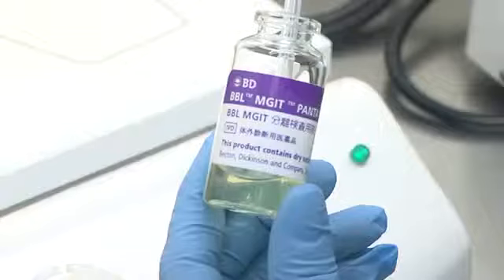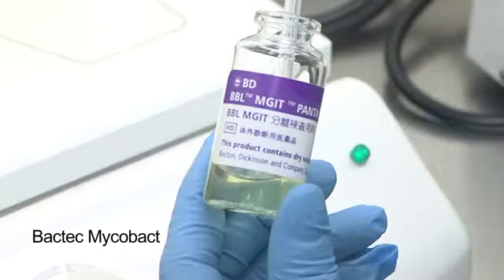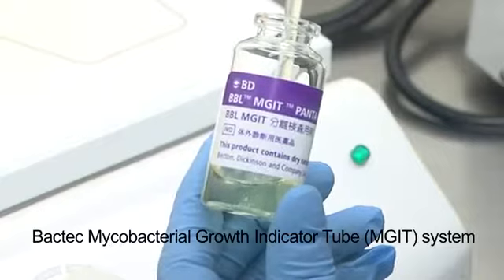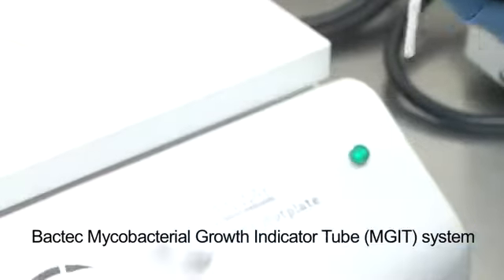The final buffered deposit is inoculated into a liquid culture media and a solid slope culture media. The liquid culture media is a commercial-based system for mycobacterial culture. It is known as the BACTEC Mycobacterial Growth Indicator Tube System, with the acronym MGIT or MIDGET.